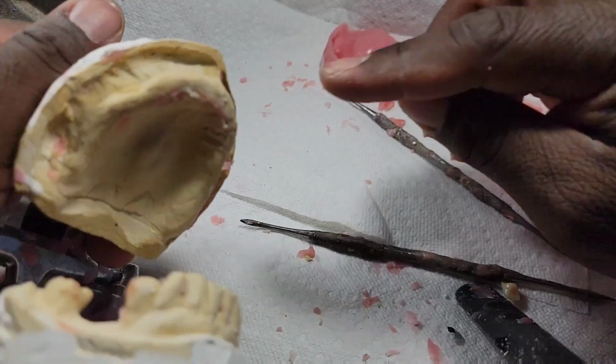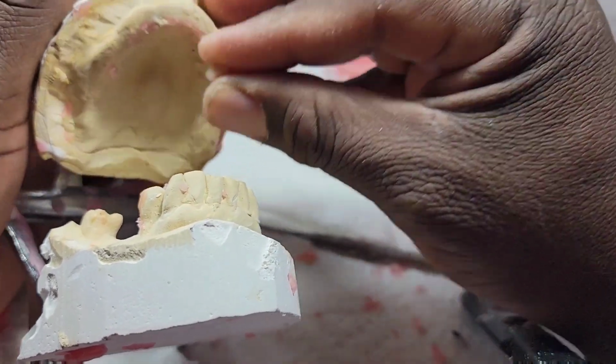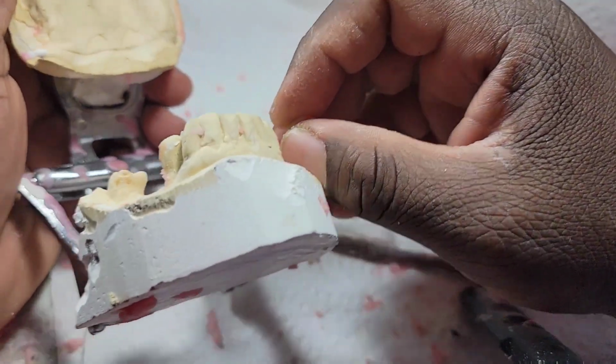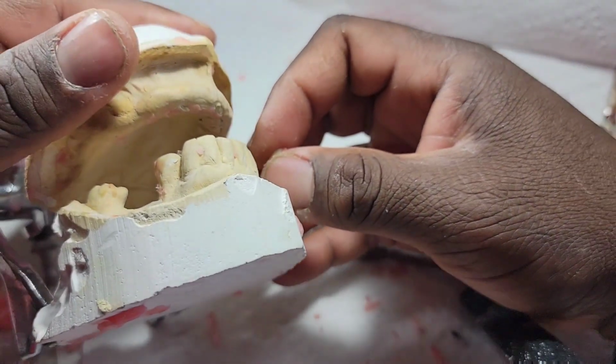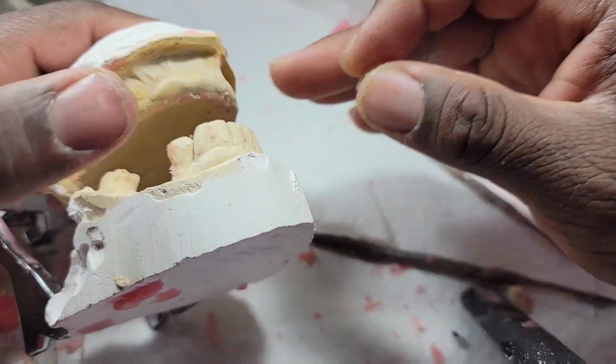It doesn't mean that person has the same bone you do. So those kinds of things have to be negotiated. You can go slightly bigger but not extremely bigger in order for all the teeth to fit on that arch.